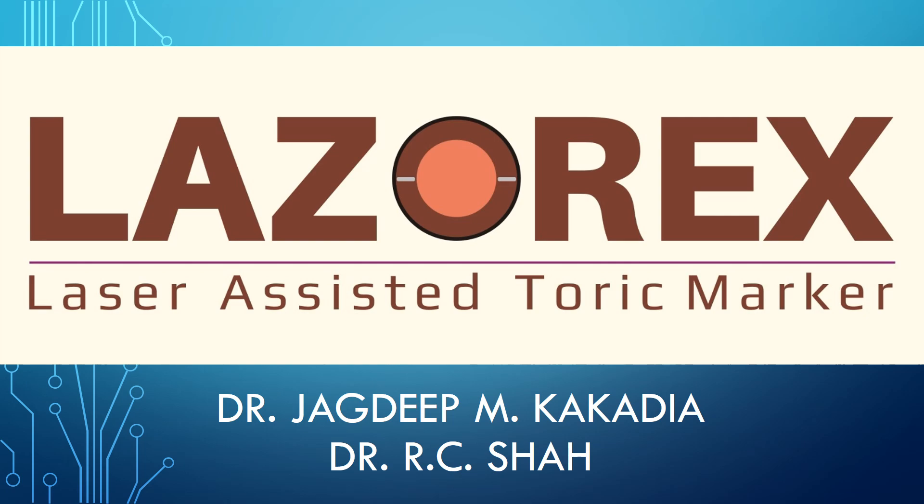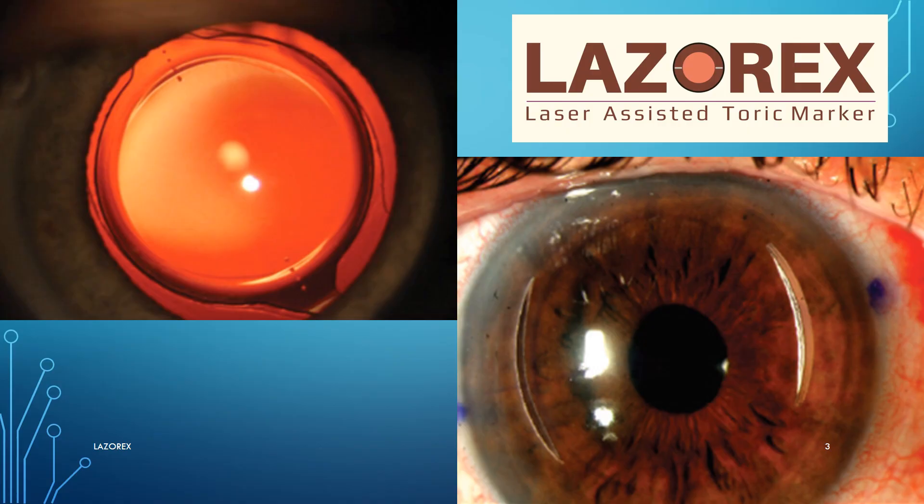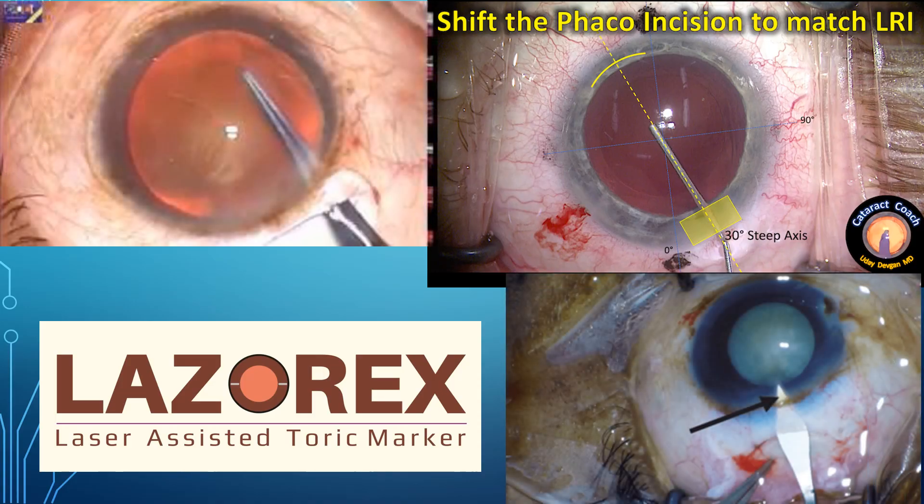Hello dear friends and colleagues, today we are very happy to introduce to you Lazorex, which is a laser assisted toric axis marker. It is a great help for toric IOLs or for astigmatic keratotomy, and also for astigmatism control by on-steep-axis incision placing in phaco or MSICS surgeries.